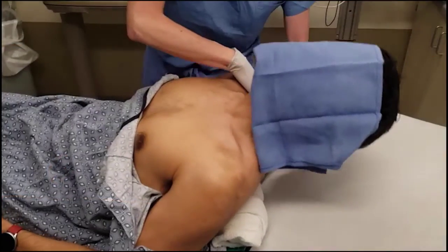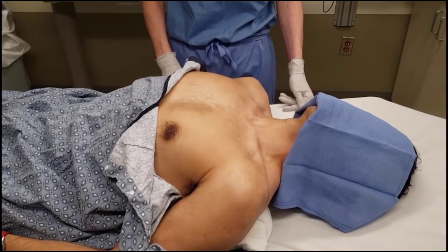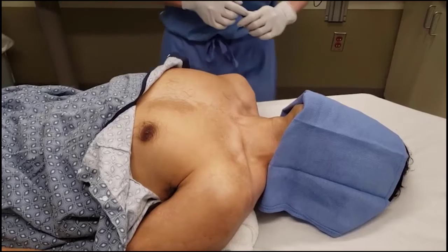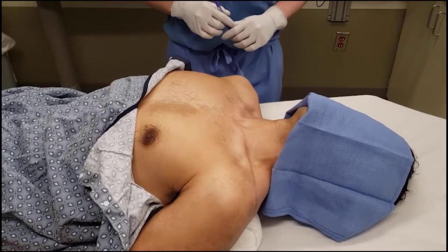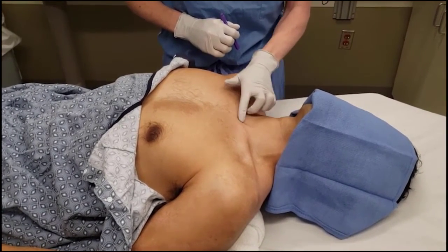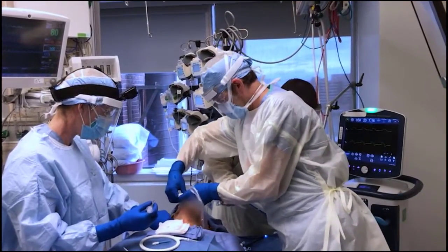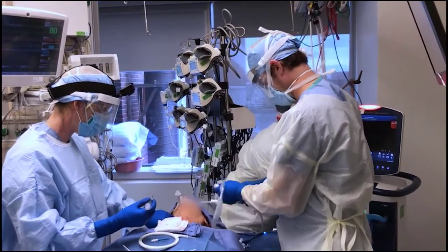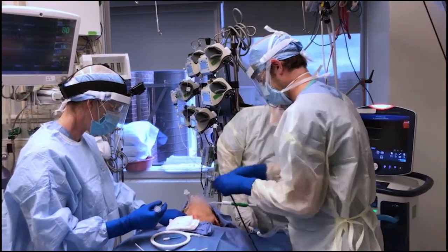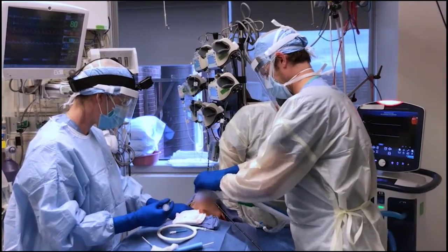Place the patient in the supine position. Placement of a shoulder roll beneath the patient's scapula can help to extend the neck and improve exposure of the anterior neck. Make sure that the patient's head is supported by a towel or small pillow if necessary. The surgeon should be able to comfortably access the patient's neck while standing, so adjust the height of the bed as needed. Make sure that each team member is positioned to carry out the necessary procedures safely, effectively, and efficiently.